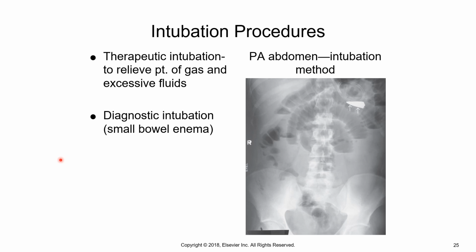You would do your overhead images, which are AP, LPO, RAO, and right lateral. Once those are checked, you would give the patient an additional cup of barium, note the time when that cup was finished, and then do 15, 30, 45, and 60-minute small bowel images all the way through until the barium has reached the ileocecal valve.